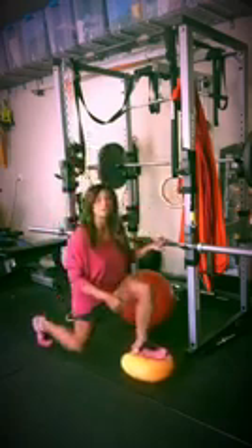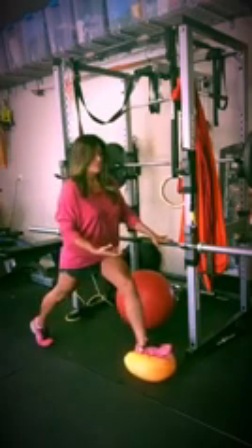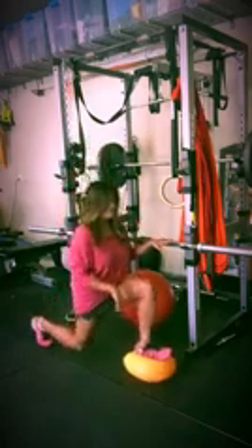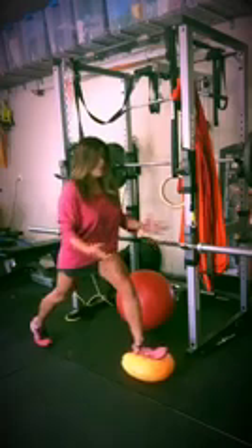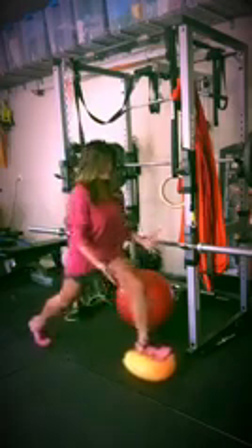So if you have problems with your knees, this is very good for all these kinds of areas — your joints, your proprioceptive GTOs or mechanoreceptors in your muscles and your joints — which will help communicate to your body better. As you can see, you can stabilize, or if you have more balance, you can practice doing it without holding onto anything.